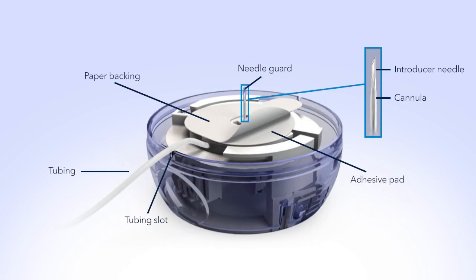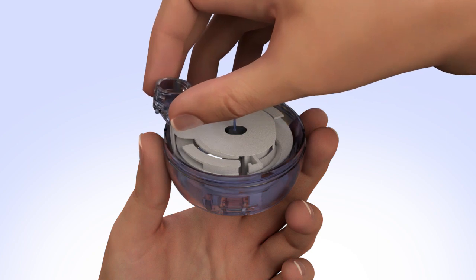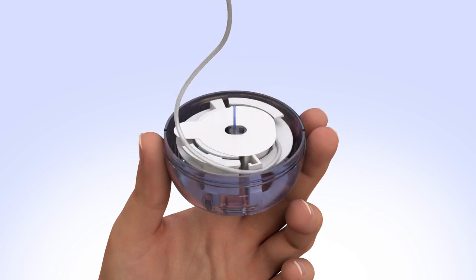Now that the lid and sterile paper have been removed, let's review the parts of the infusion set. To release the tubing, start by freeing it from the plastic tab that holds it in place. Then gently unwind the tubing by pulling it upwards in a counterclockwise direction. Be careful not to pull too hard when the tubing is fully unwound, as this could accidentally dislodge the infusion set from the introducer needle and insertion device.